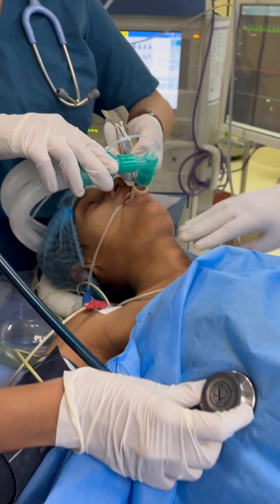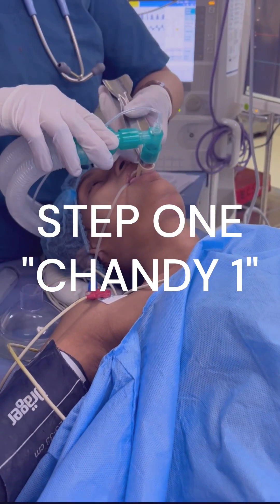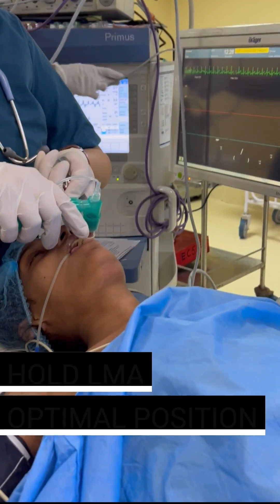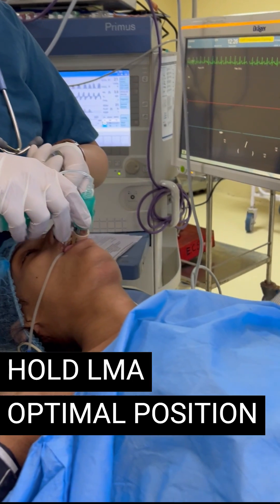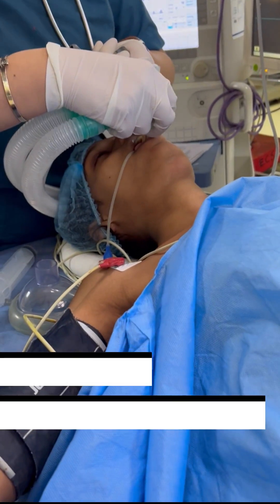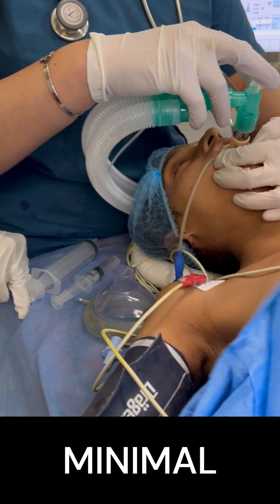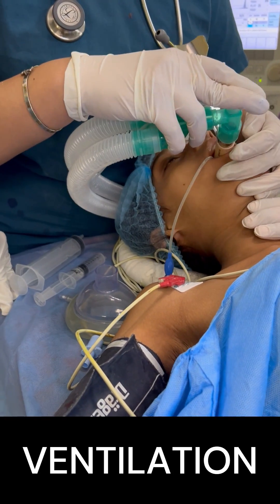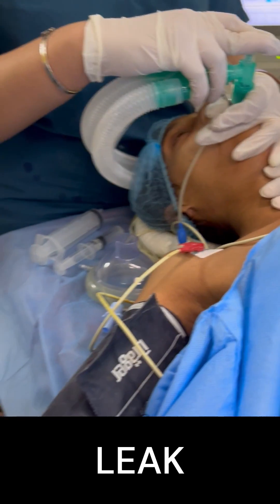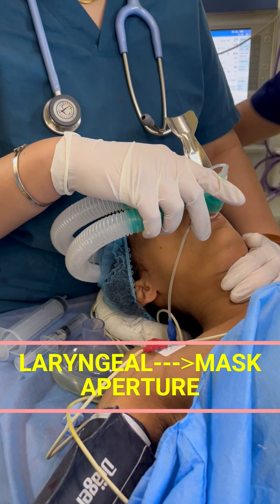Chandy Maneuver comprises of two steps. Step 1: After inserting the LMA Fast Track, hold it in optimal position to establish optimal ventilation with minimal resistance to bag-in-mask ventilation and audible leaks during manual ventilation. This first step aligns the laryngeal aperture and the bowl of the mask.